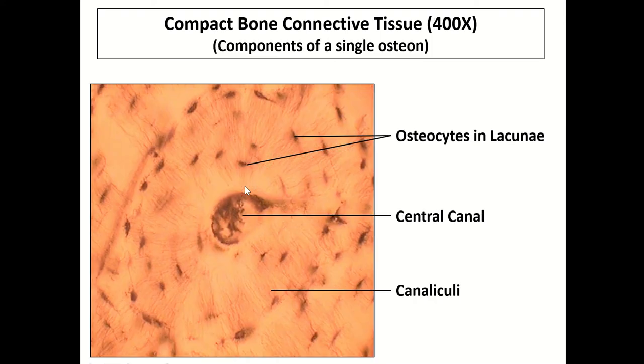And as we zoom into those, that's where you find the osteocytes in this slide, so those bone cells. Now, these are going to be housed in lacunae, but you can't see those quite as well as you can in spongy bone. But nonetheless, you can see them denoted right there, picking up a darker stain. So they tend to arrange themselves on those lamellae, so in that nice circular pattern.